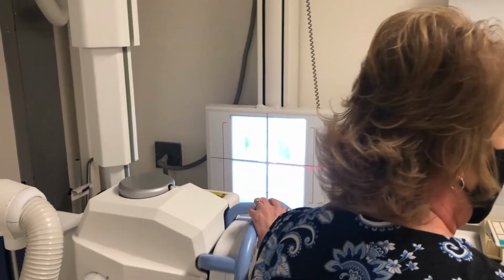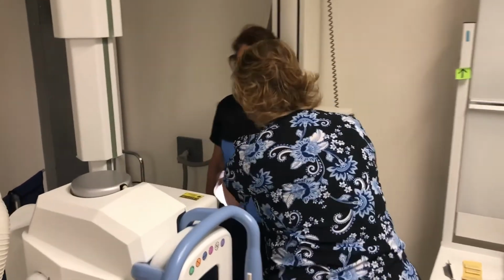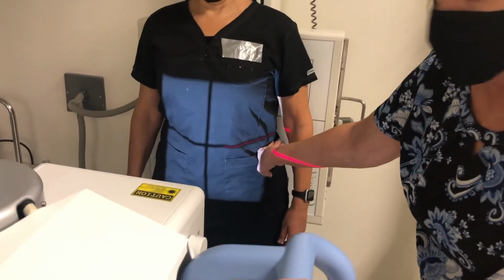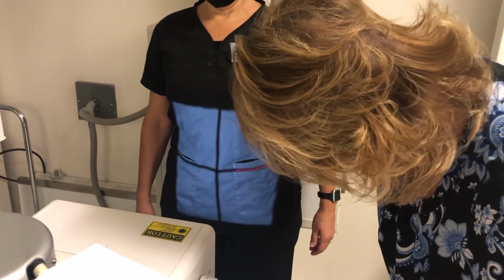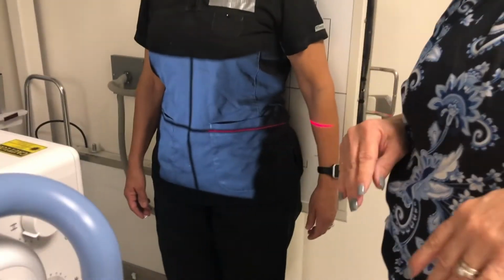Okay, Raina, this is the last one. Stand with your back against the board there. Once again, I'm going to feel for the top of your hips. So I estimated pretty close, but I'm going to need to come down. This definitely has to include her bladder.